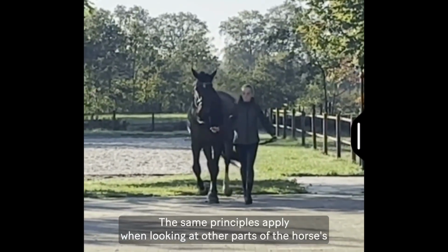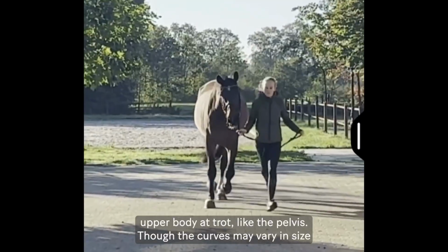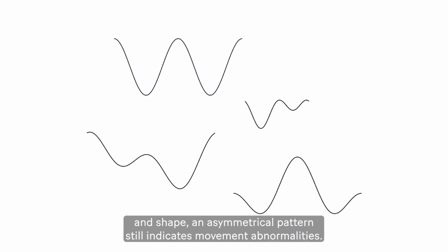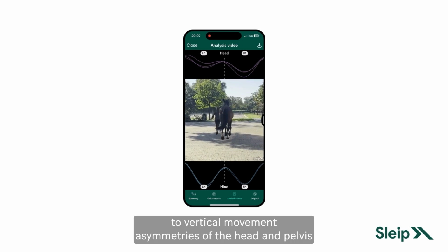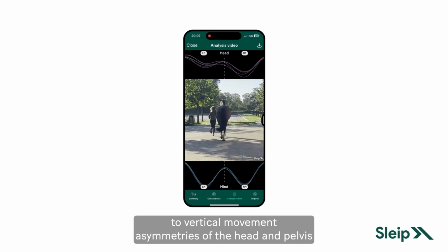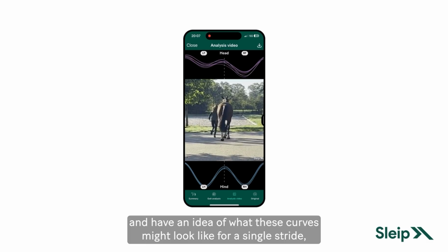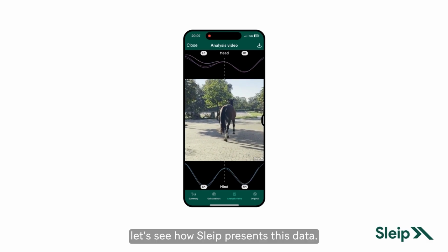The same principles apply when looking at other parts of the horse's upper body at trot, like the pelvis. Though the curves may vary in size and shape, an asymmetrical pattern still indicates movement abnormalities. Now that we know that weight-bearing lameness can lead to vertical movement asymmetries of the head and pelvis, and have an idea of what these curves might look like for a single stride, let's see how Sleip presents this data.